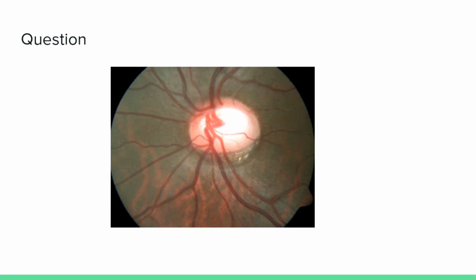It's the color photograph of the left optic disc. It's a little large in size. I think the disc is also tilted horizontally. The inferior rim is thinner than the superior rim. A cup disc ratio of 0.7. Yeah, there is nasalization and there is peripapillary atrophy as well.